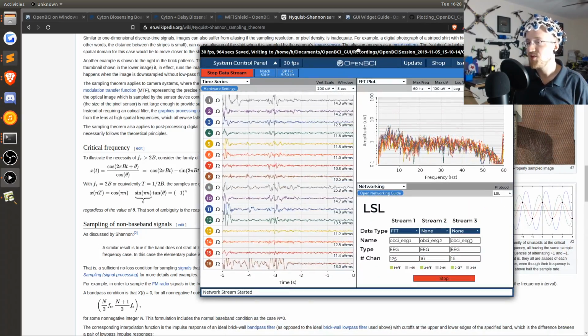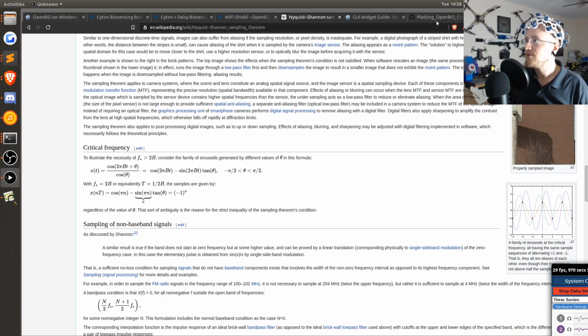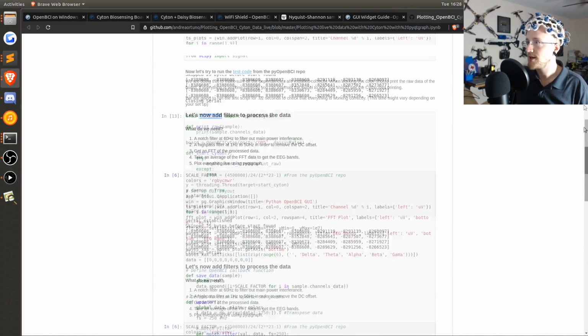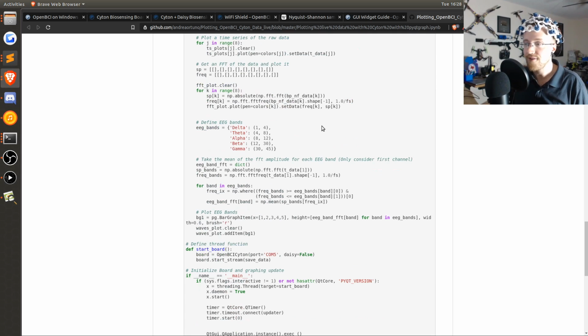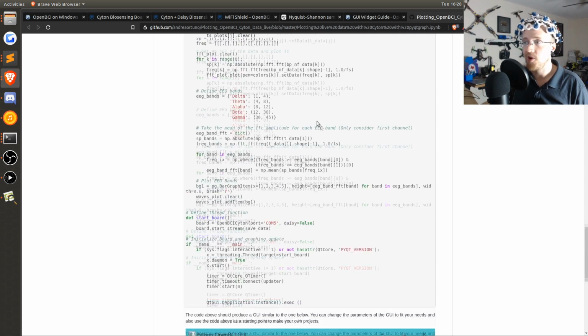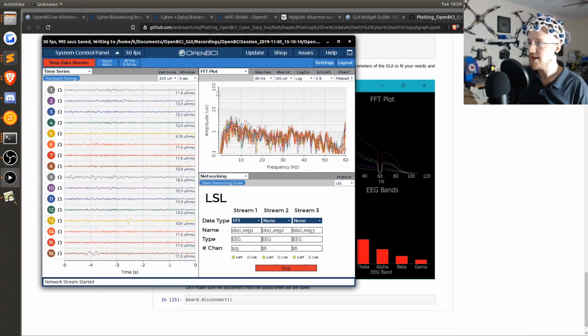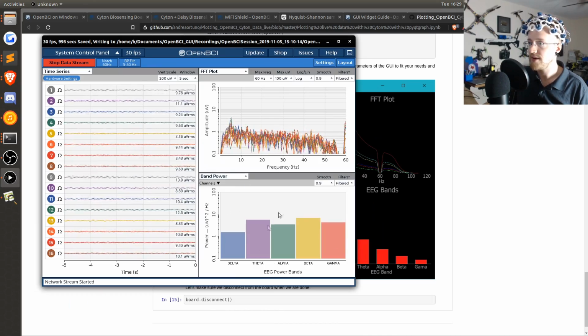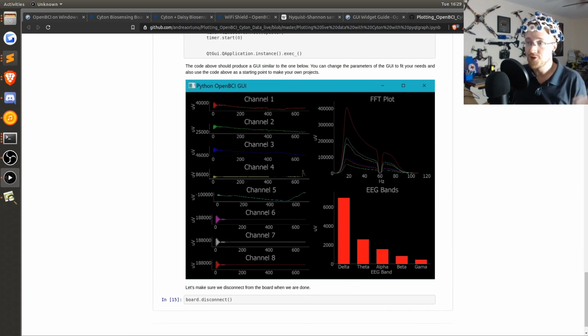So anyway, I was discussing with the people at OpenBCI over email, and they've been super helpful. One of the things that they linked me to is this Jupyter notebook that uses the OpenBCI and also combines PyQtGraph. I've actually never personally used PyQtGraph, but it's really cool. This is a really cool example of it, if nothing else. And this is what it should look like. It's almost like a replacement of the OpenBCI GUI, especially if we did band power down here, right? So in theory, it's just kind of OpenBCI GUI in Python, which is just cool.